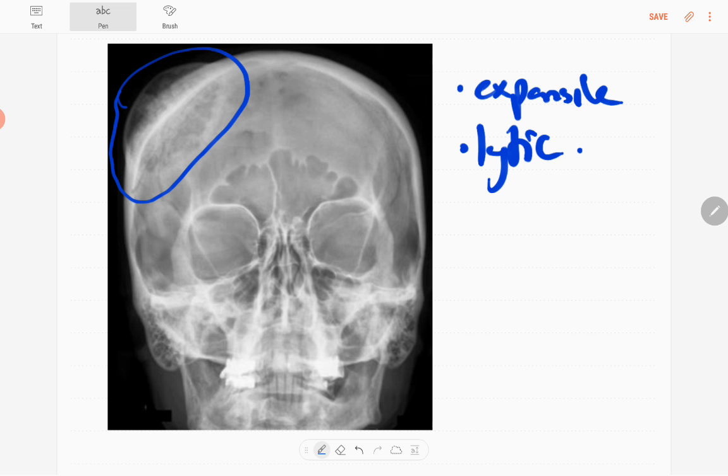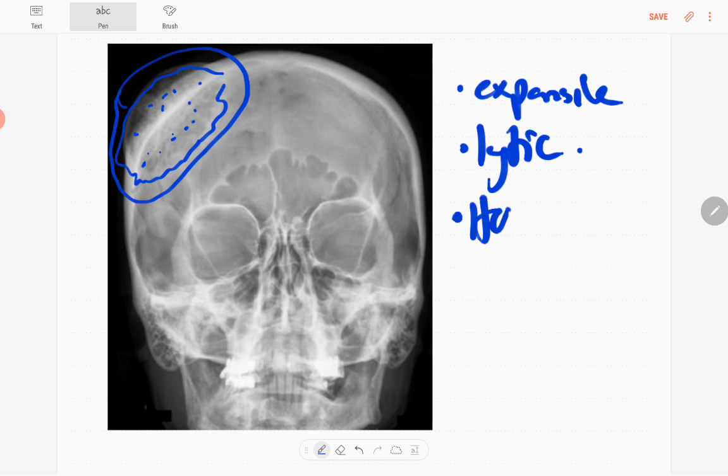There are coarse trabecular patterns here. You can see coarse trabecular pattern is there, giving rise to honeycomb appearance.